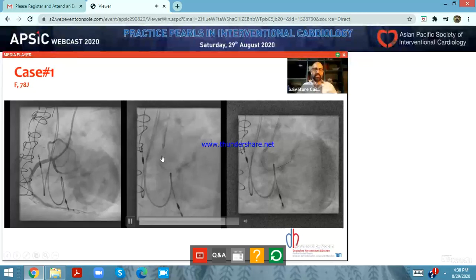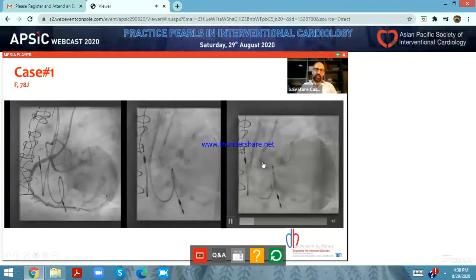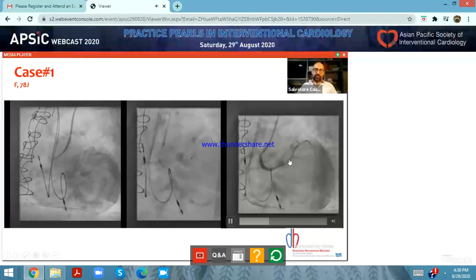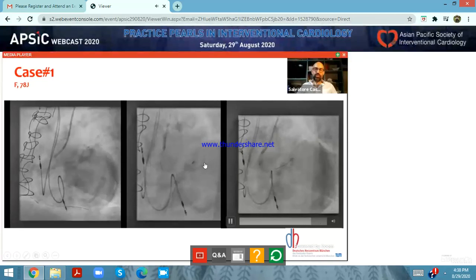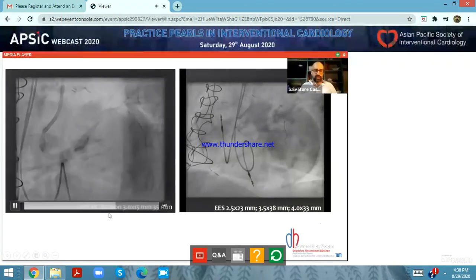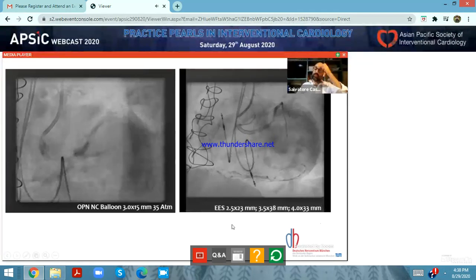This was the seventh run of rotablation in this vessel. And as you can see, also with the guiding extension device and CTO guide wires, it was possible to cross the LCX in that way. Then after post-dilation with the ultra-high-pressure balloon, we achieved a satisfactory result with the implantation of three stents.